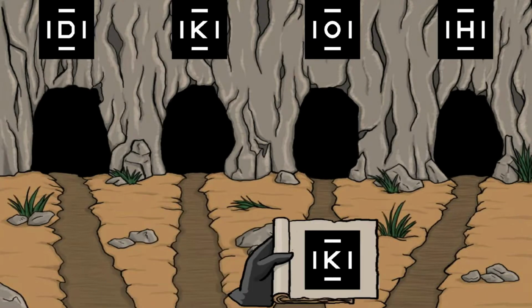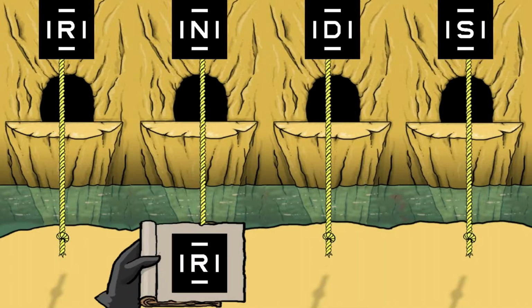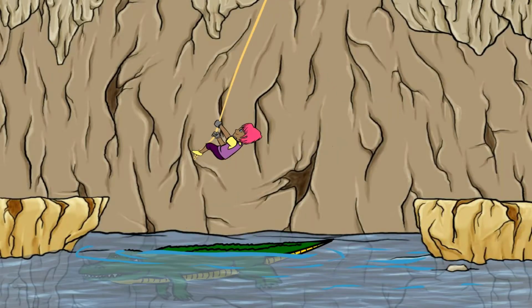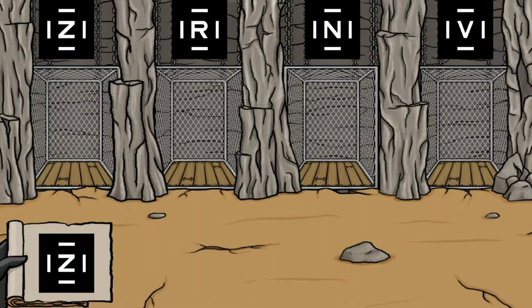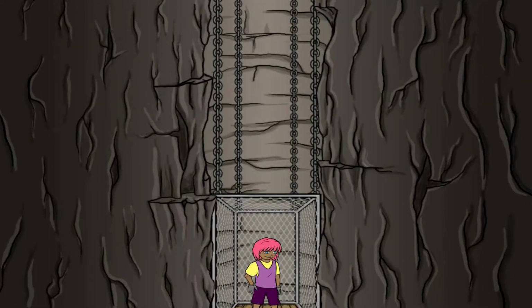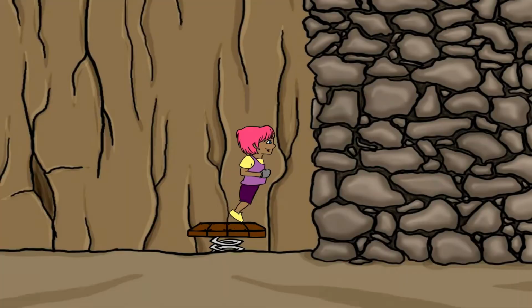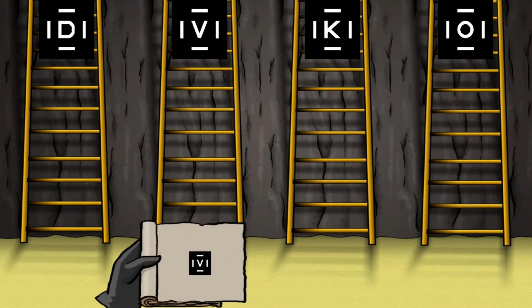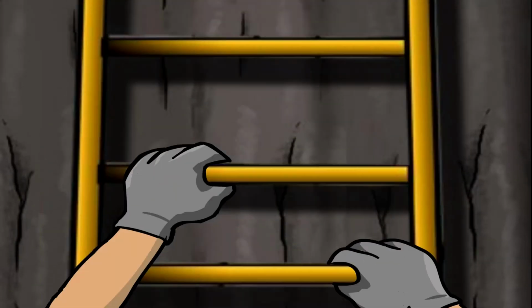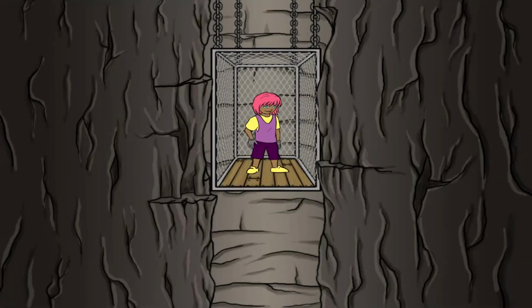Okay, so now you can see it's a very simple matching game. What Colton's doing right now is just looking at the top, sees the letter at the bottom. The characters, the letters, whatever's being shown is automatically selected based on the age of the student, so you don't have to worry about selecting the correct chart. And what you'll notice is that the letter at the bottom of the screen is getting smaller and smaller automatically, so you don't have to worry about how far down the chart you go. It's doing that for you.